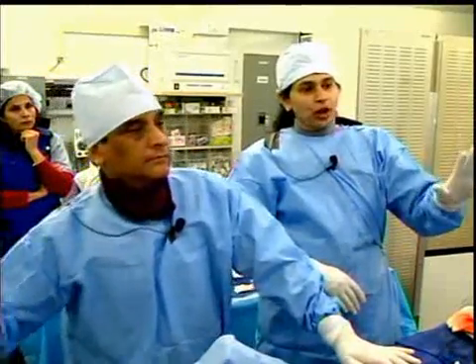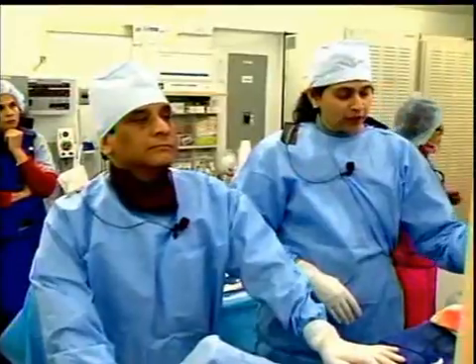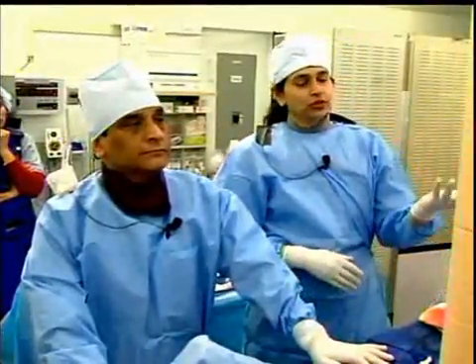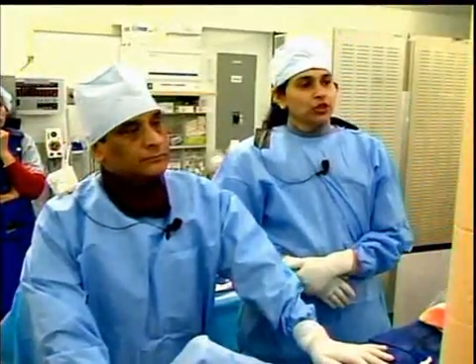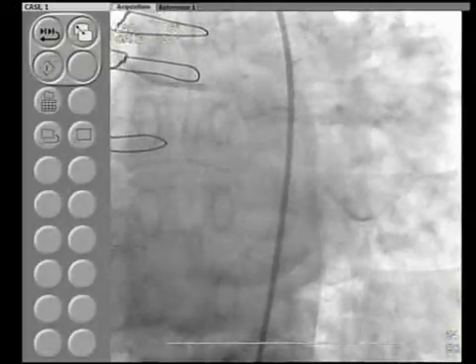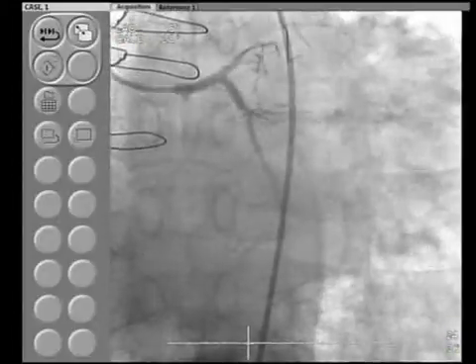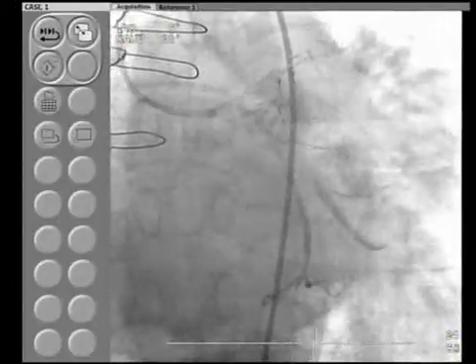As you see, we stopped there, and there is nothing wrong in bringing this patient back next time. For the viewers, you can see it when he comes back during June. We may in fact see a nice antegrade flow, and all we will have to do is go through that. You already see a nice channel there. We'll be able to just put a stent, and the distal vessel, everything looks good. And the most important teaching point of this is to know when to stop.